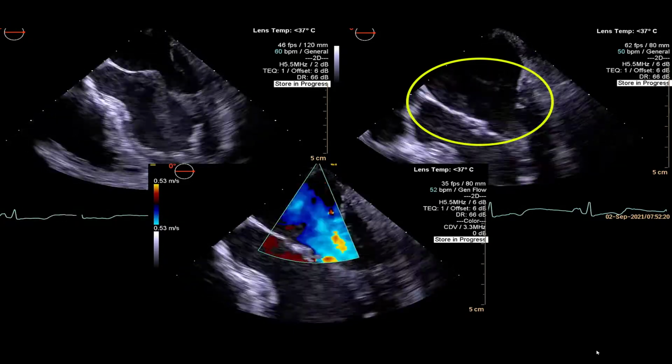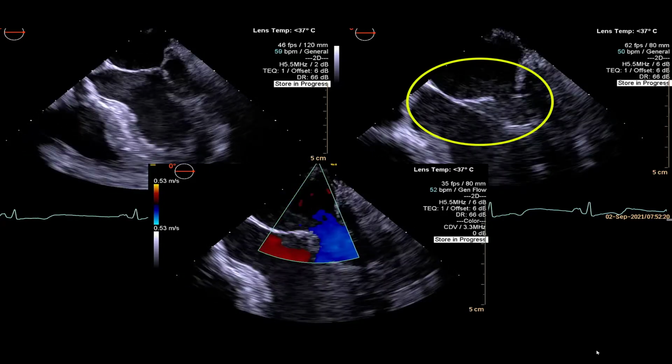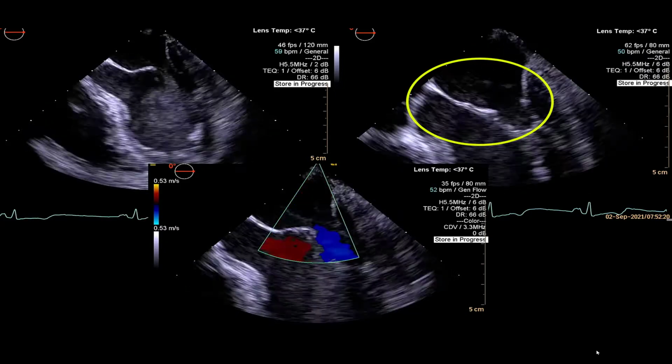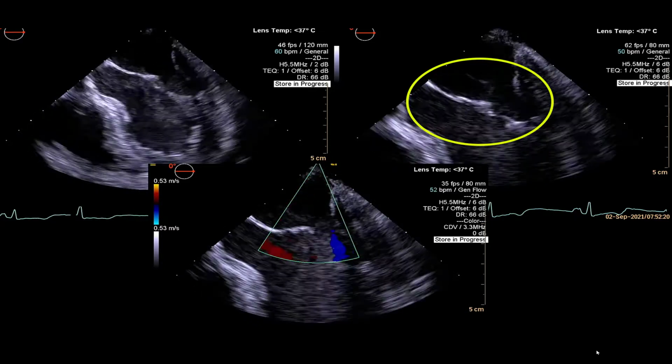Would you be concerned about the position of this strut cord, and would you have a different clip strategy? Which means, would you choose an extra wide clip or the not so wide clips for this one?